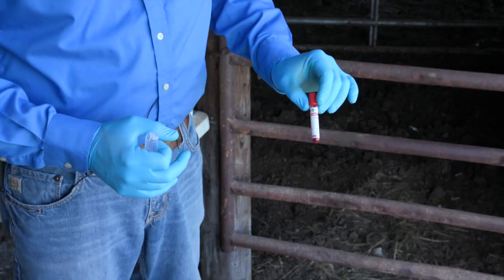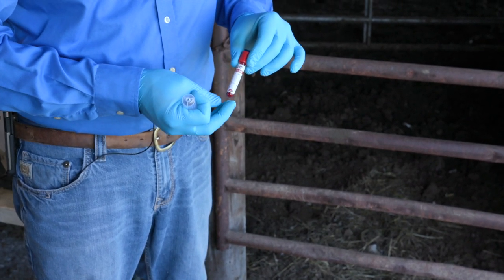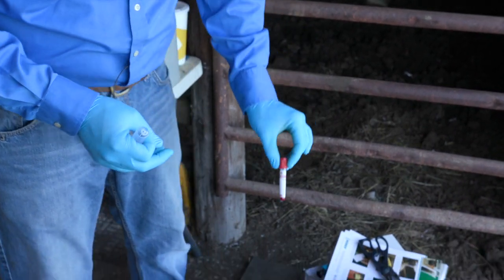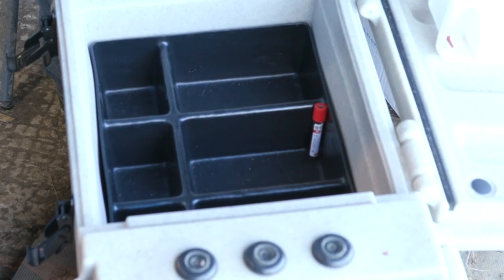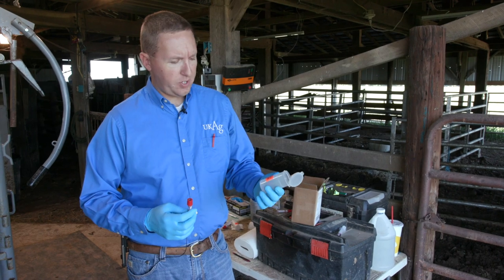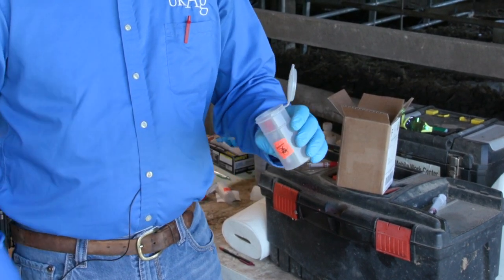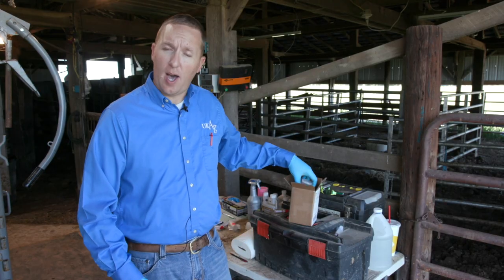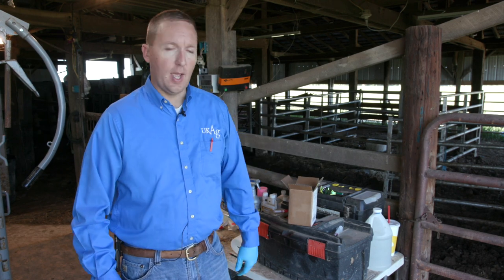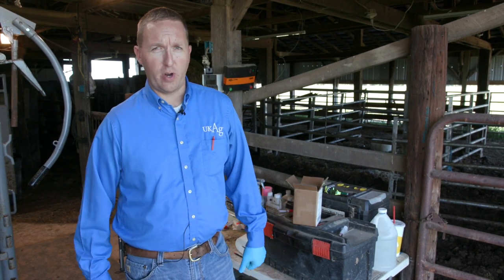We have our blood tube with the sample collected. I like to keep a cooler that's relatively cool — not freezing, around 60 to 70 degrees — and set the tubes with the red top up, leaning against a tray or in a piece of Styrofoam to keep them upright until we send them off. When ready to mail, we use the flip-top containers from the kit — about five or six tubes per container — seal them up, put them back in the original box, and use the pre-printed mailing labels included to send straight to the lab.